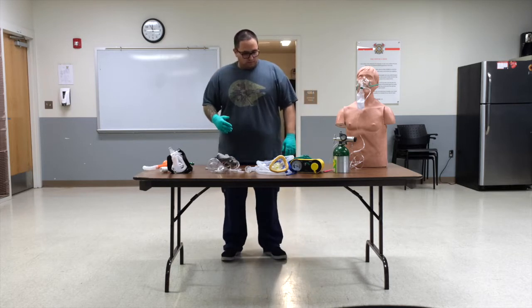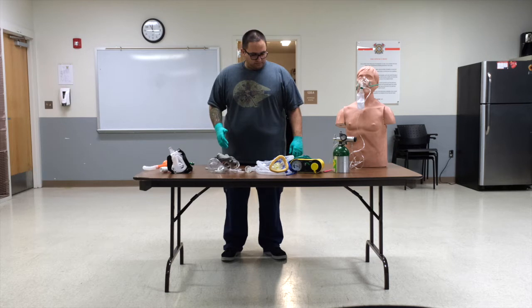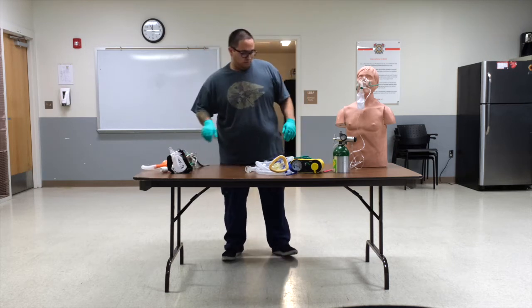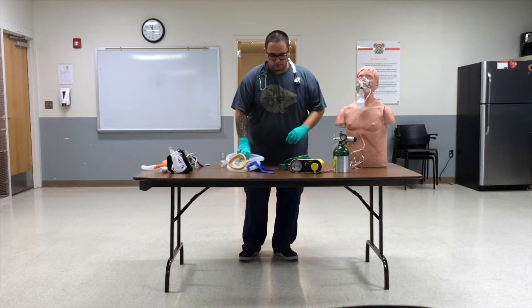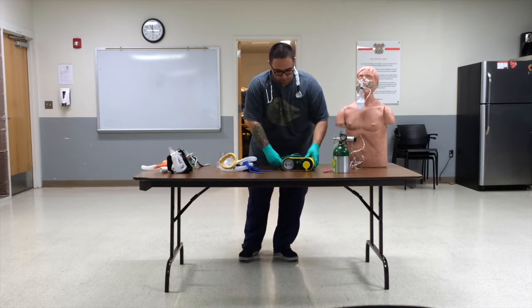For the purposes of the demonstration, we're going to use the CPAP-O2, which is this machine right here. As we're also assessing your ABCs, make sure that the airway is patent, open, and not obstructed. If you do find any issues with that, fix it and move on.